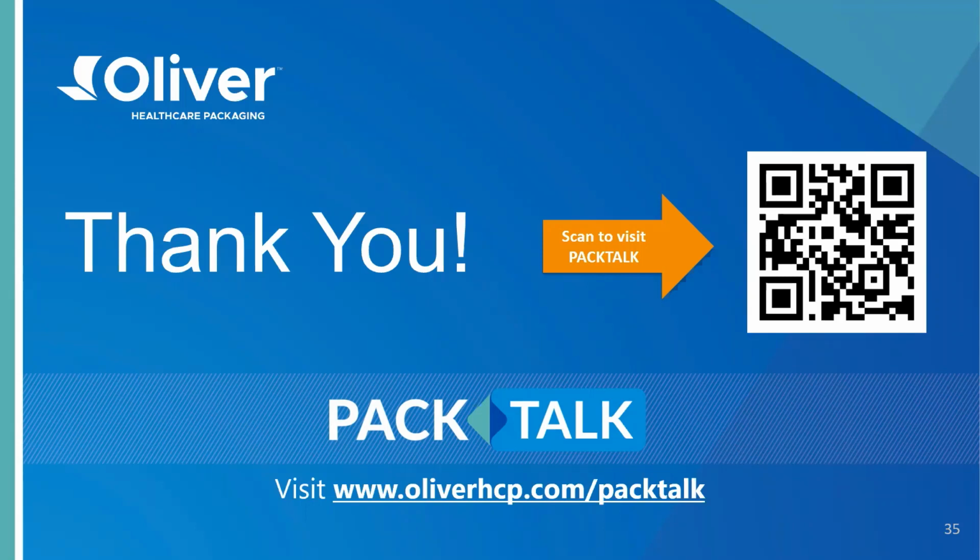Just as a baseline, the most common seal widths are 3/8 inch wide and 10 millimeters. And although in the end the best seal width is really the one that works for the application, which means that it depends on the situation. So seal width choices typically have to consider seal creep. So if seal creep occurs, how severe is it through sterilization and distribution stresses, etc.